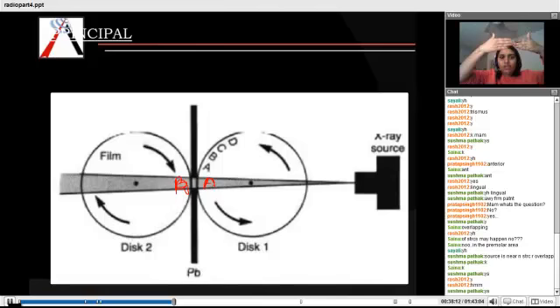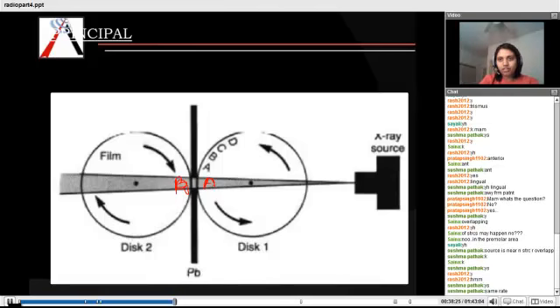Now why does that happen? It's something like when two buses are moving in the same direction at the same speed, the people from one window can talk to the other window. It's a simple logic, right? Yes, they're moving at the same rate. So here the film is coming like this, and they are coming straight on to each other, and they become stationary and face each other. They are stationary relative to each other.